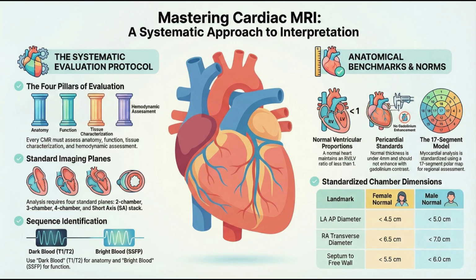So that pressure difference pushes the wall to the right. Exactly. The septum should be convex toward the right. It should look like the left ventricle is kind of bulging into the right. But, and this is where the diagnostic punchline is, what if it's flat? Or what if it's bowing the other way? If you see that the septum is flat, or worse, bowing into the left ventricle, the physics have reversed. It means the pressure in the right ventricle has spiked higher than the left. You've likely got pulmonary hypertension or some kind of massive right heart failure.